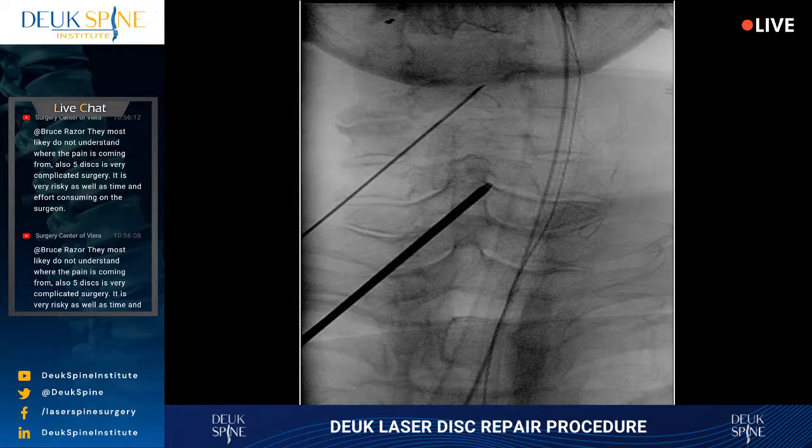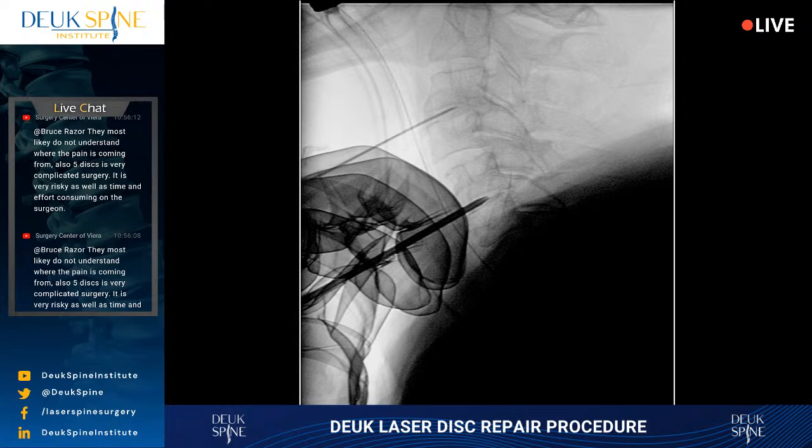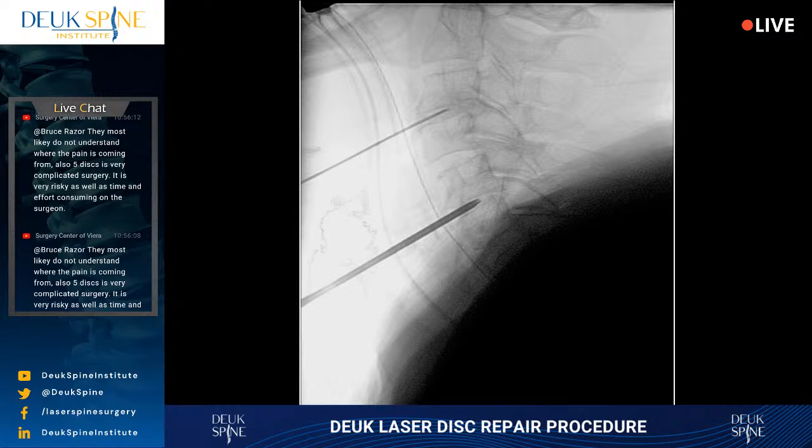Yeah, we're heading to the proper side. No, 5, 6. All right, let's go back to a lateral. He's still relaxed, right? How many twitches does he have? Barely one. Not even. All right, good. I don't want him fighting me with his neck musculature. Shot. Shot. All right, yeah, definitely collapsed at the back there. Shot.